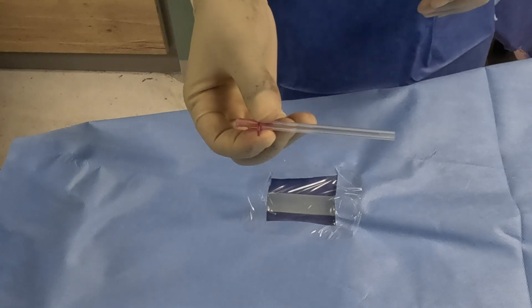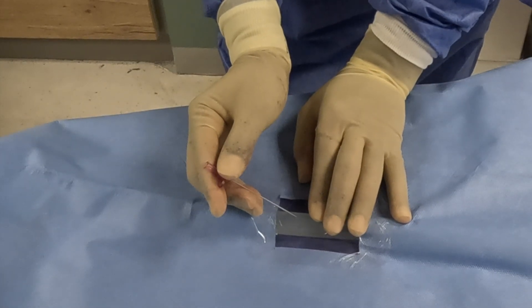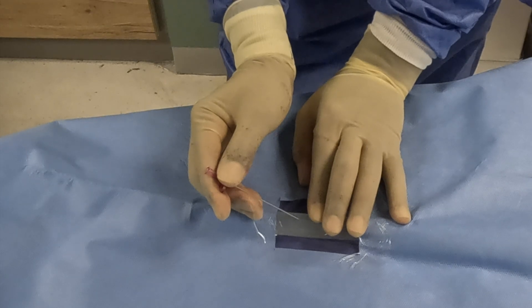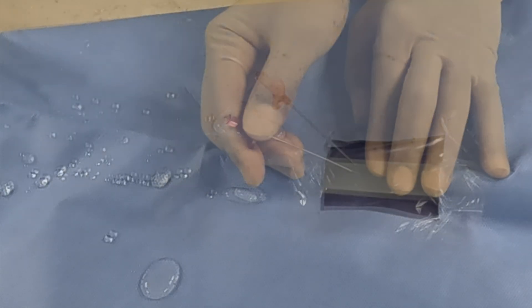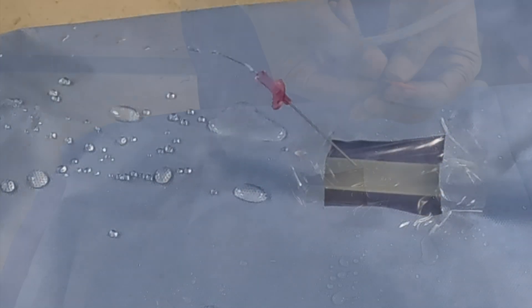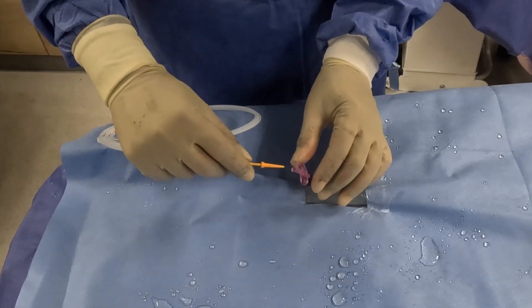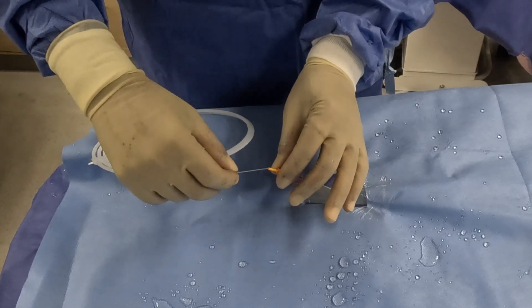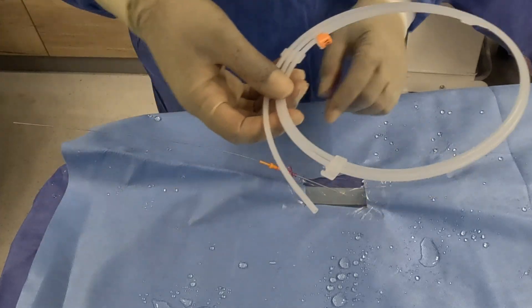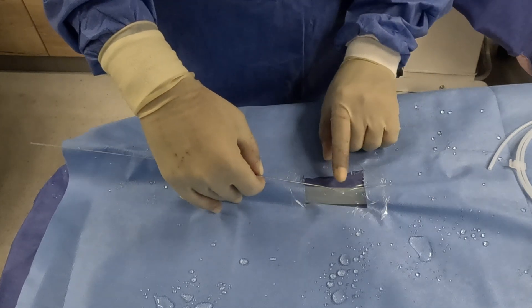Using ultrasound guidance (which is preferred) or palpation, locate the target artery. Insert a needle into the artery at a 45-degree angle. Confirm arterial access by pulsatile blood return. Advance the sheath guide wire, which is 55cm long, through the needle into the artery. Remove the needle while leaving the guide wire in place.